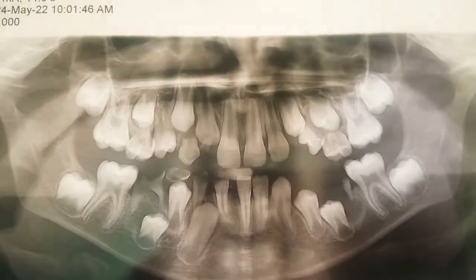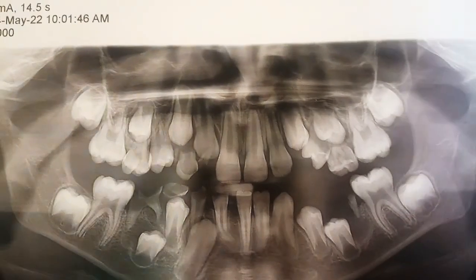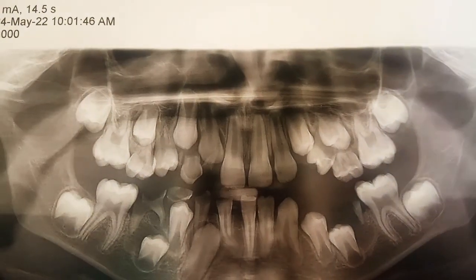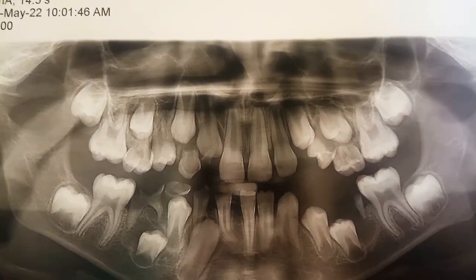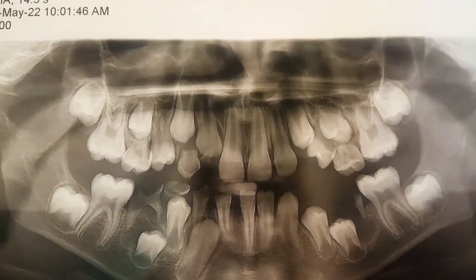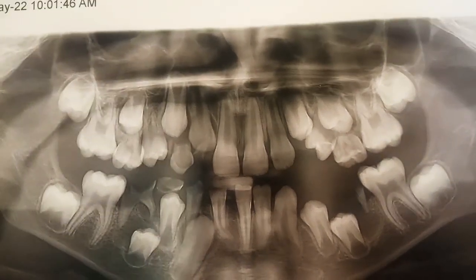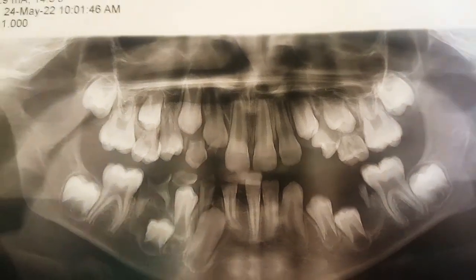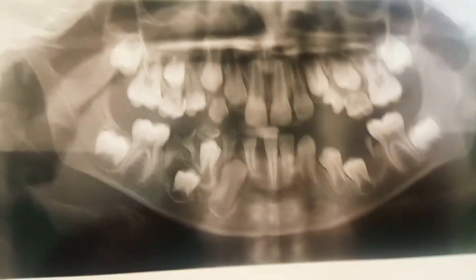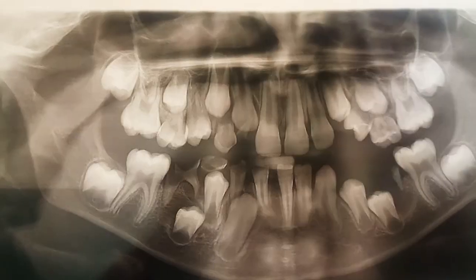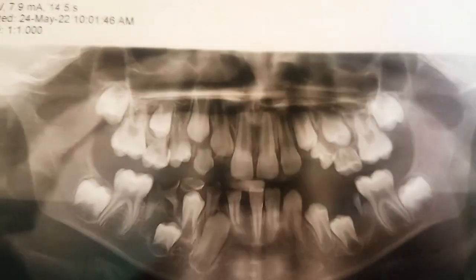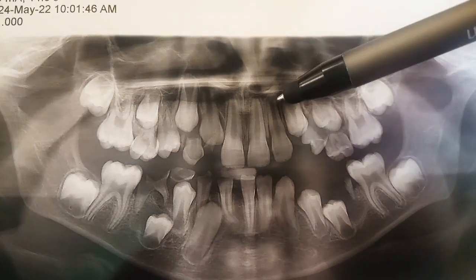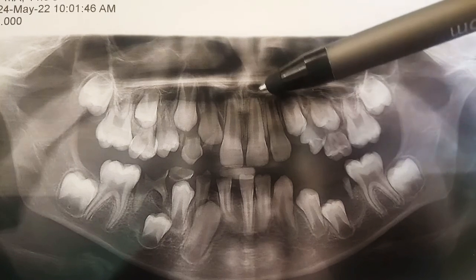The lower first molars have closed apices. So can you tell me what the age of this child is? It might be a little difficult, but please take a guess and comment it in the comment box.